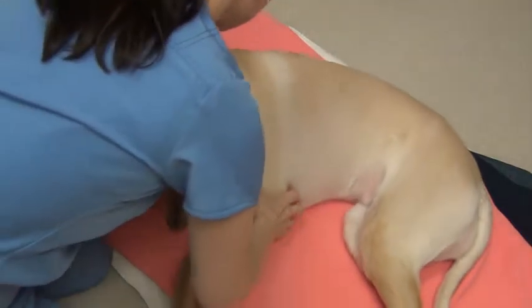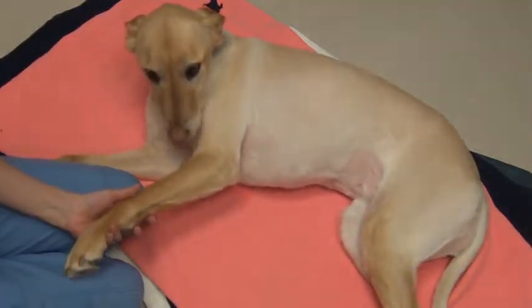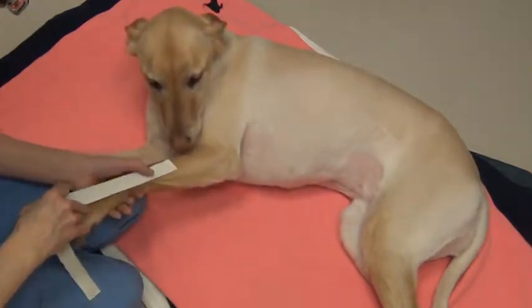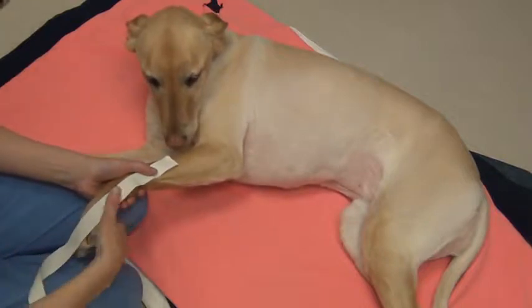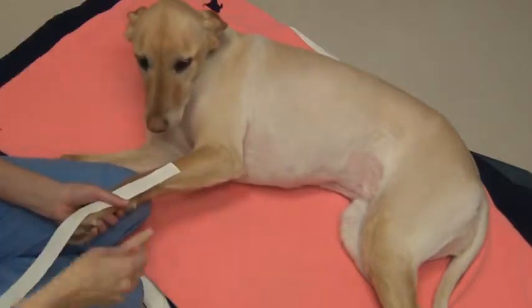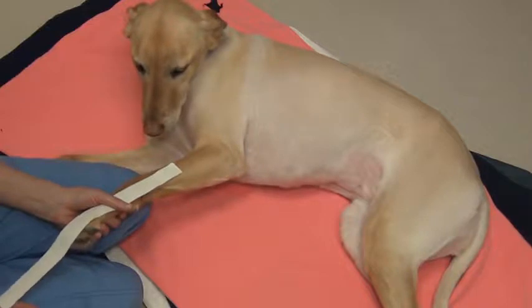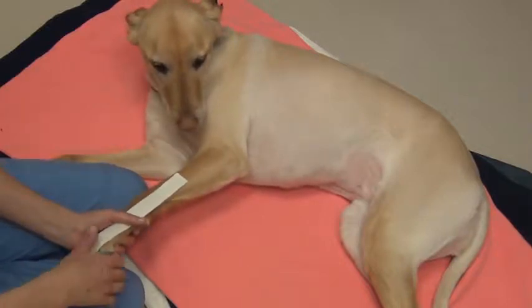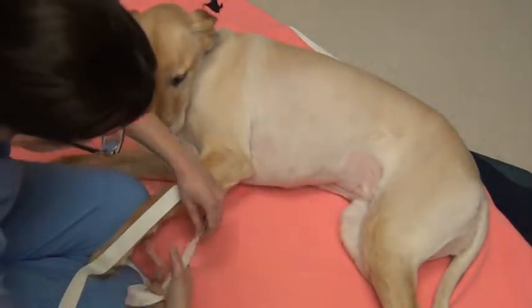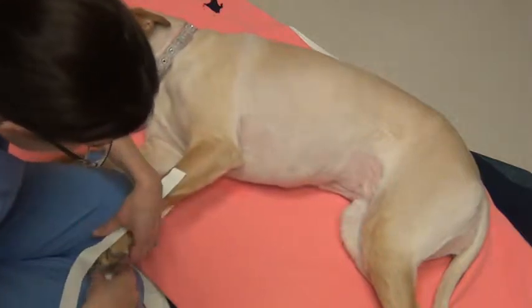Alright, Miss Daisy, we're going to have you lay down. Good girl, Daisy, good girl. Alright, so we're going to start by applying a piece of tape onto the lateral aspect of the leg. And we're going to apply our tongue depressor on there, to use as a lever to keep our tape from sticking. On the first one, on the lateral aspect, this is not very sticky tape. Then our other piece will be on the medial aspect of the leg. Same thing. I'm going to put my tongue depressor on there too.